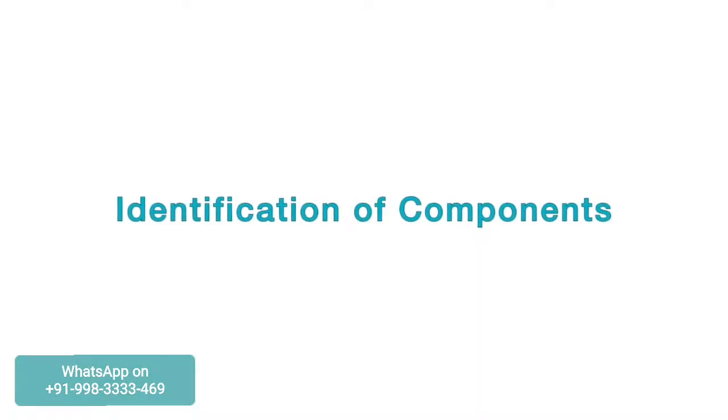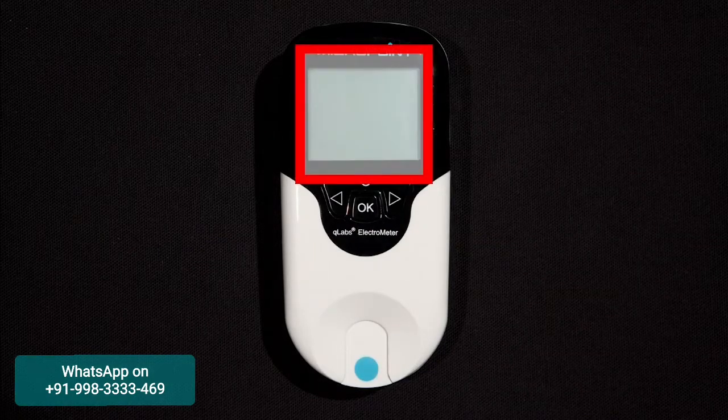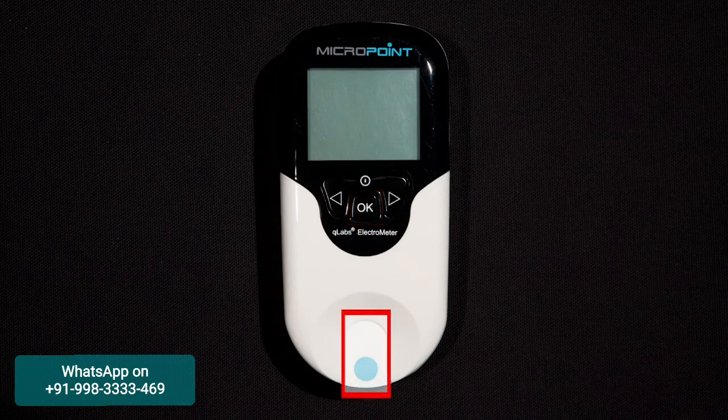Let's begin by identifying a few components on the Q-Labs Electrometer. In the front, we have an LCD screen, the power button, the left and right arrows, the OK button, and the test strip guide where the test strip will be inserted during testing.